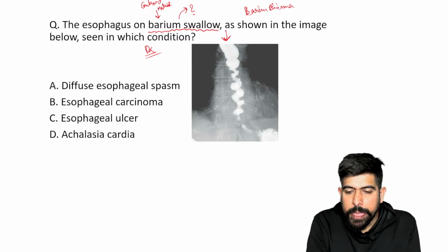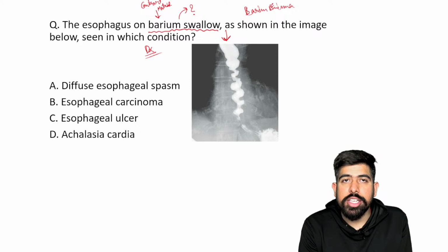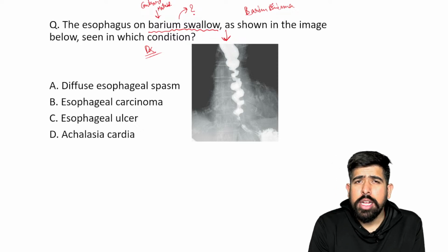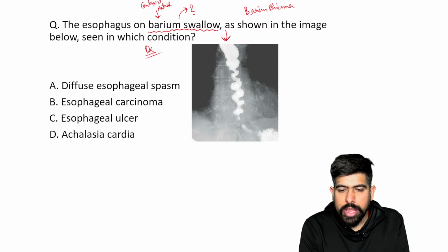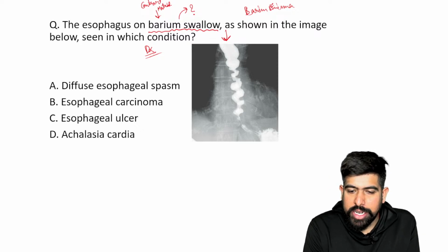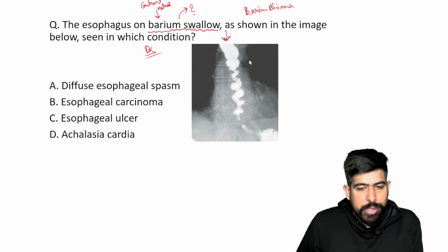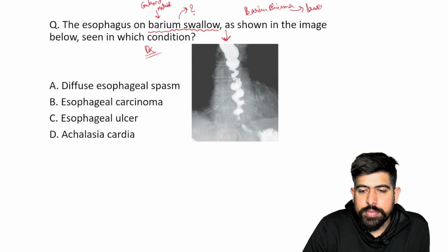Yes, enema is for the rectum, for seeing the large intestine and the colon, including the sigmoid colon. Most commonly the barium enema is done for ulcerative colitis and Crohn's disease. I will show you the lead pipe sign in ulcerative colitis on the barium enema. So please remember, if it is barium by mouth, this is for the upper GIT, and if it is an enema, this is for the lower GIT.